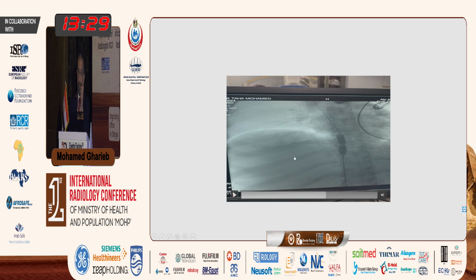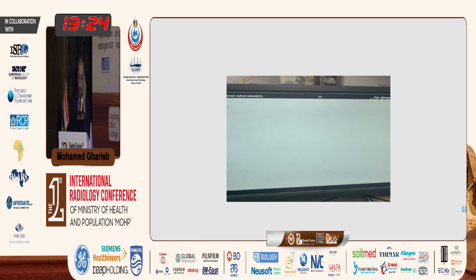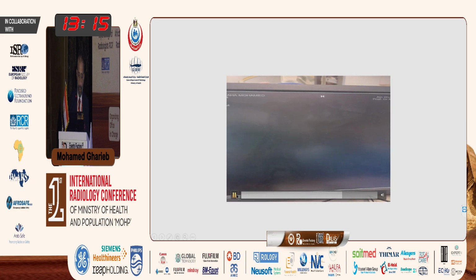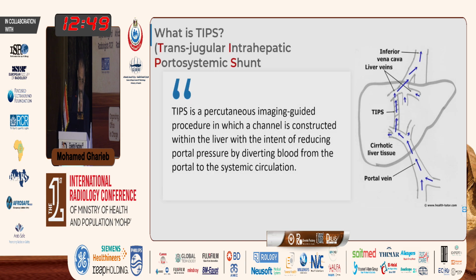Yet it seems the stenosis in the first place seems longer, but however it's a web, and thrombosis is superadded on it. Placing a stent in a patient who may later on need transplantation needs a good decision and consultation about these issues, because putting a stent in the IVC near the right atrium in a patient who may undergo living donor liver transplantation may be dangerous.